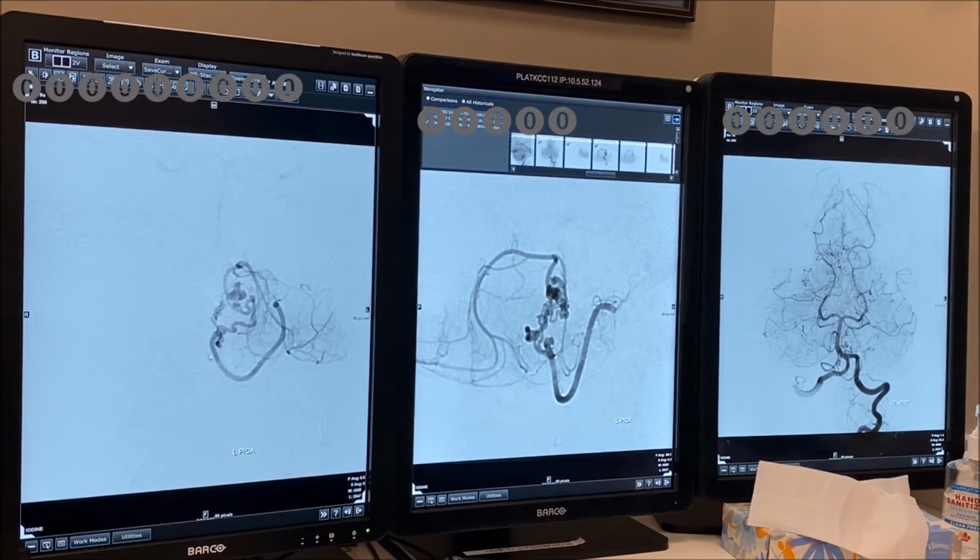So I know that I cannot super selectively catheterize this thing to go coil each one of them. So what can be done? And how do I work it out? What are the options? I think liquid embolics would be the only thing you'd be able to use to take out the entire lesion. Liquid embolics, but how do I put it? Where do I put it? How do I predict if I'm going to give her a cerebellar stroke or not? How can I work those things out? Because I can do a bypass too. PICA bypass, and then sacrifice the segment.